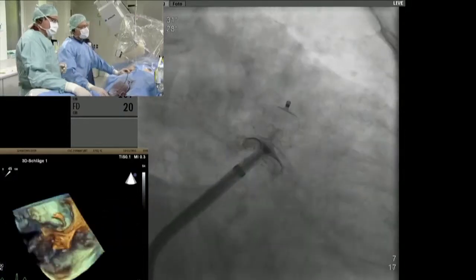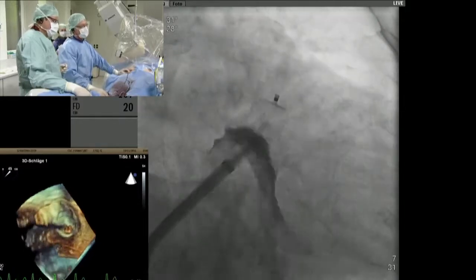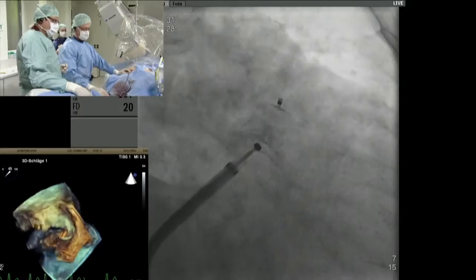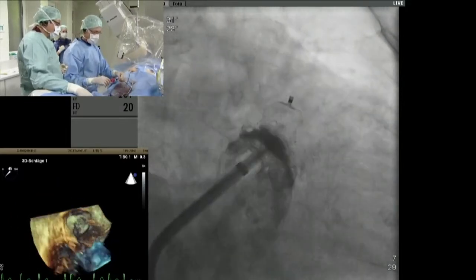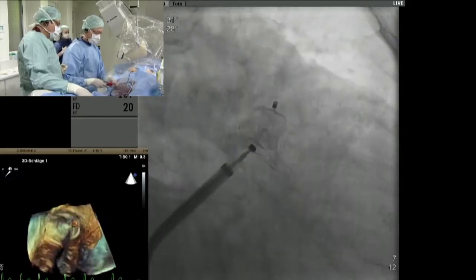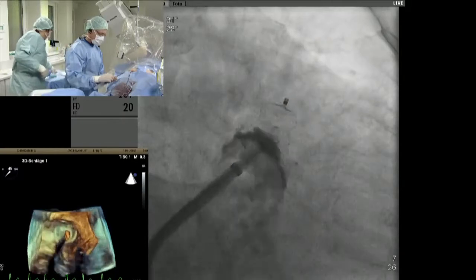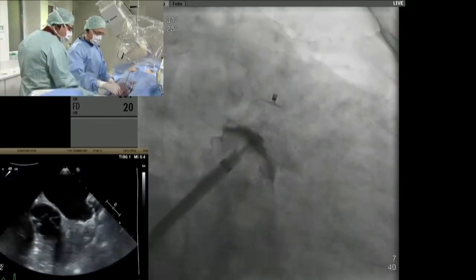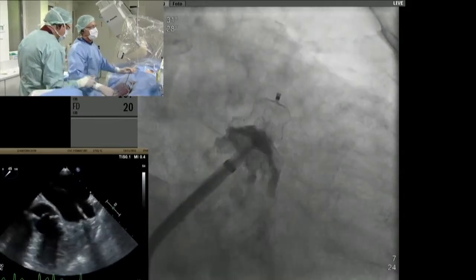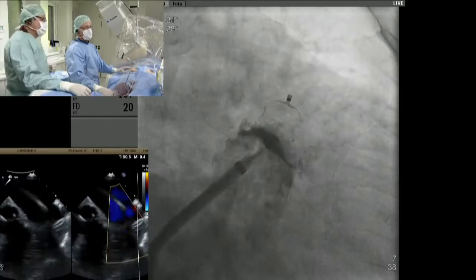But this is still the 18 device? Yeah. So I would go again with the 25. I would expose the lobe to the ball configuration before I was in the superior lobe, just in front of where there is this lobe division, and try to have the perpendicular orientation of the lobe. So everybody agrees that the 18 is not an option?